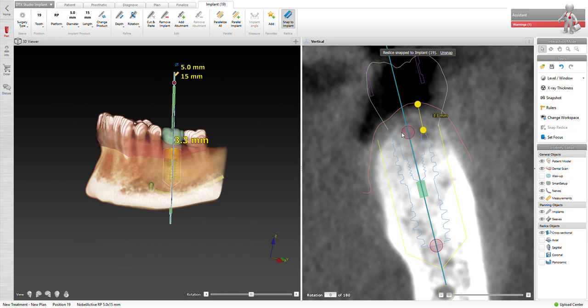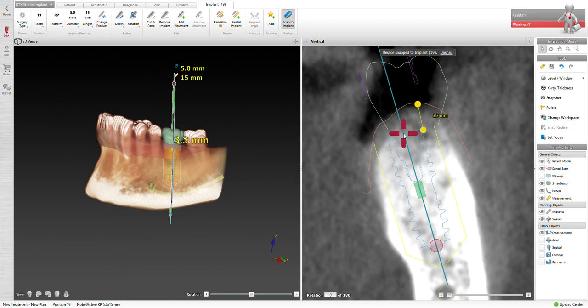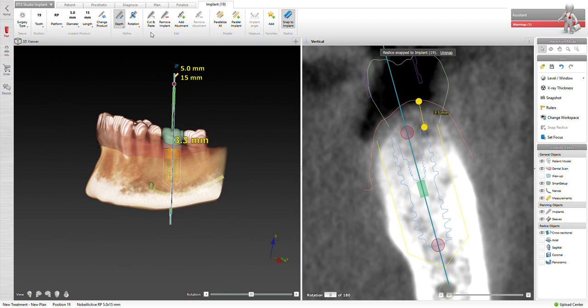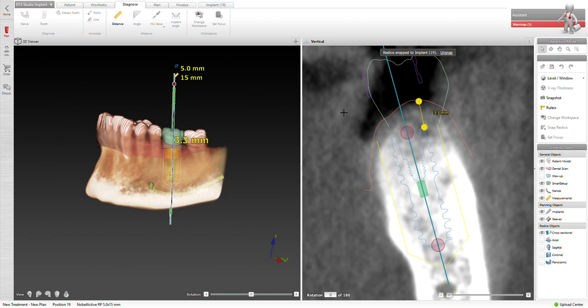3.3, that's not bad. I could probably take that down a little bit. Okay, I can go ahead and highlight the implant and go back to editing. I'm going to probably need more than from here to here, so I can rotate that. I can take it down the depth. I don't trust my hand, so I can manually move it more precise. That actually looks pretty good. This area is our worn area. We typically want one and a half, it's one and a half from here to here between an adjacent tooth, and then it's two at the apex.